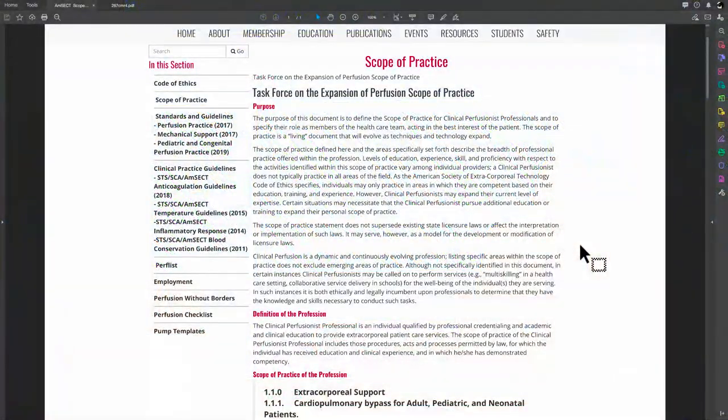Isolated limb, use or performance of physio, that's easy. Use or performance of central hypo or hyperthermia. Man, okay, so they do therapeutic hypothermia now with various jackets that they put on. Almost no one does it extracorporeally. No one puts a Mahurkar catheter in, uses a cardioplegia heat exchanger, runs it like you would just a closed loop system. I think you would be highly efficient at cooling the patient down and have a more controlled temperature drop and maintenance. But currently they just use those cooling jackets.